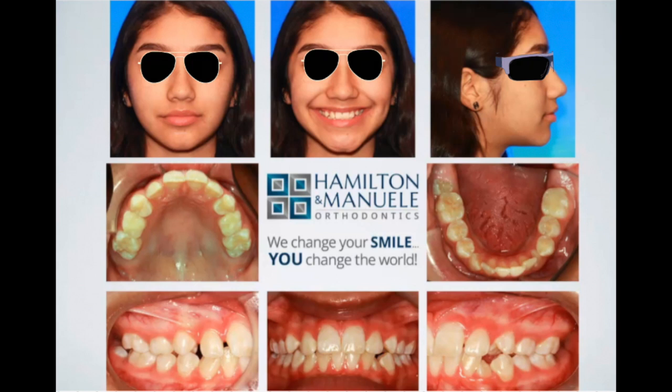What else? Okay, yeah, so a cant with what side being inferior? Well, left on the screen or her right side, right? So her right side's a little bit more inferior than her left side. Let me ask this question. Do you think that her occlusal plane angle is more steep or more flat?